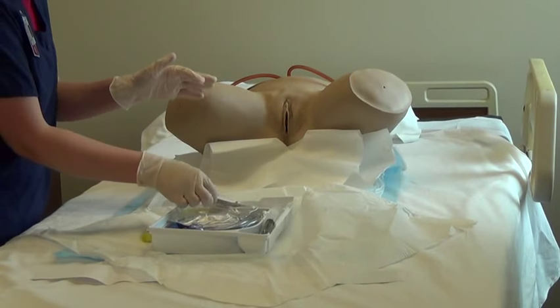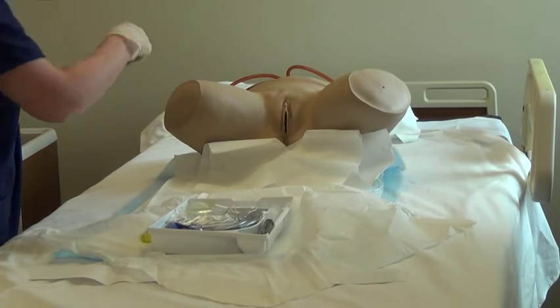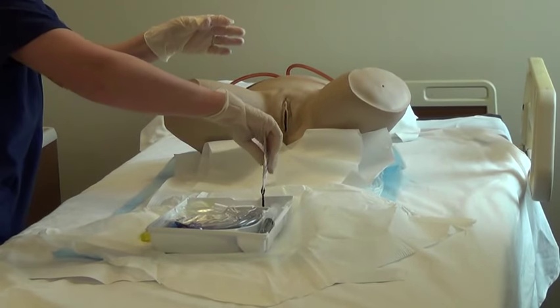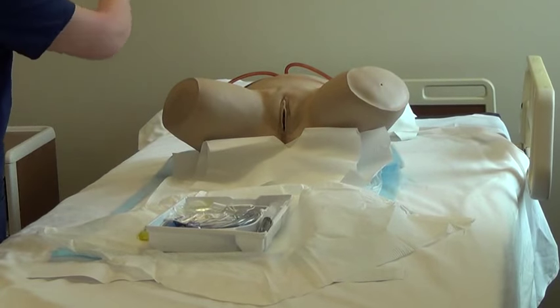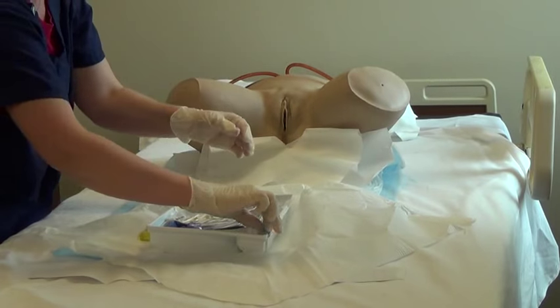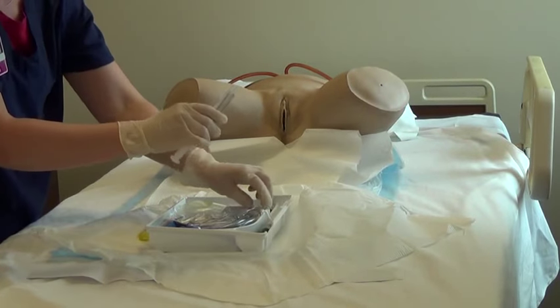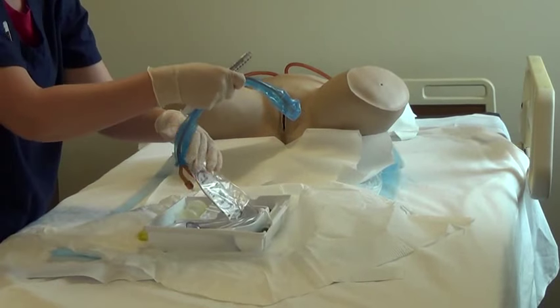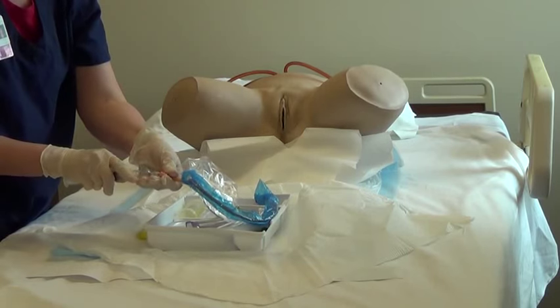Open the packet of povidone iodine. Pour the solution onto the 3 foam swab sticks to saturate them. Attach the syringe filled with sterile water to the inflation port. Do not pre-test the balloon on silicone catheters, as this can cause a crease in the base of the balloon that can traumatize the urethra upon insertion.